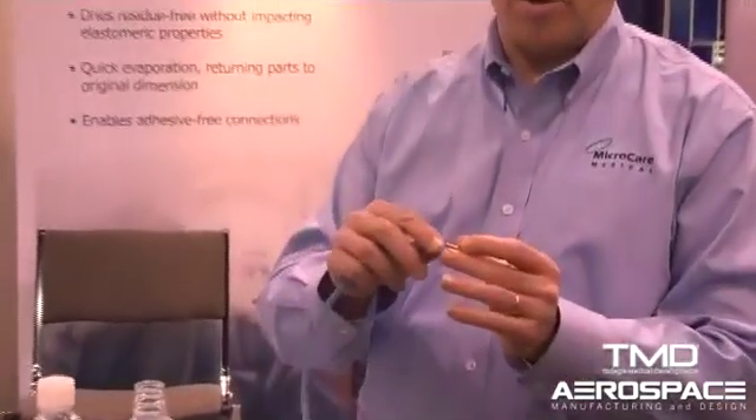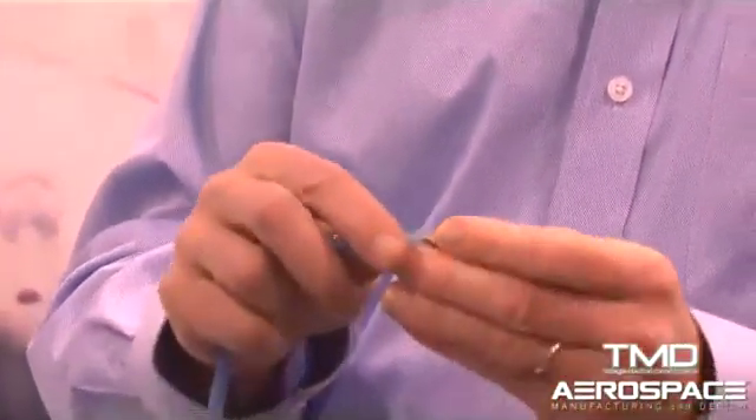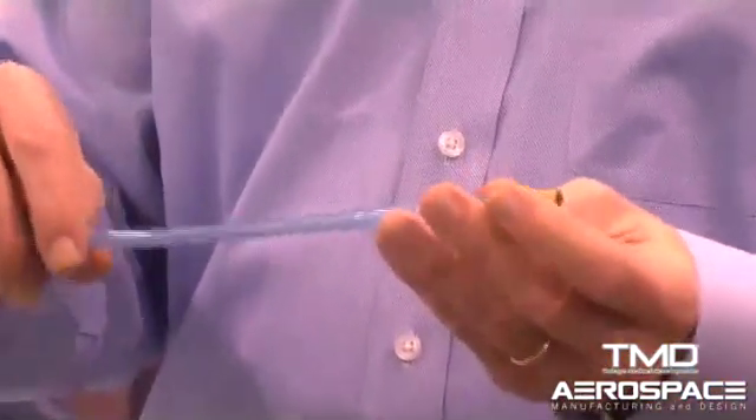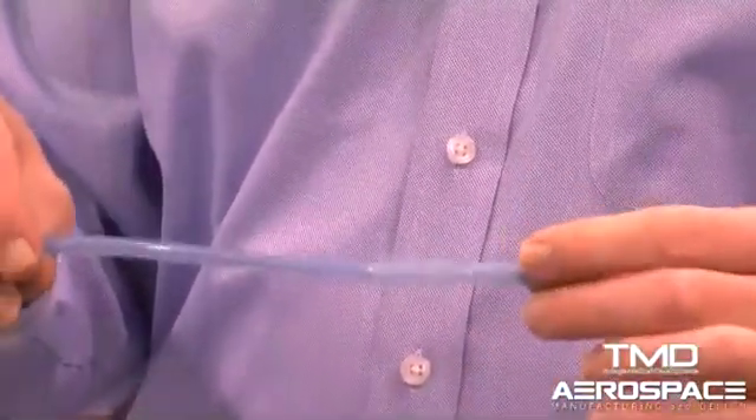Here's a barbed fitting. I'm putting it on the untreated end and it's very difficult to fit. But if I take it and put it onto a treated end, it fits right on nice and easily, slides on easily. And within a few minutes, this will recover back to its original size and shape with a good secure fitting on that barbed fitting.